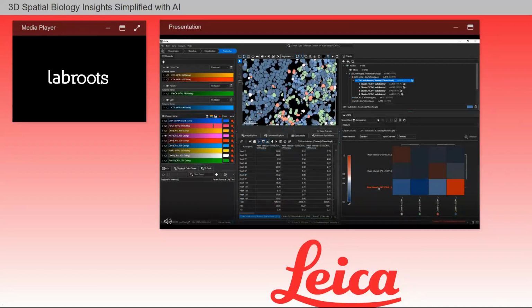I can also sort the dendrogram tiles by right-clicking on the header and selecting ascending or descending to sort the tiles by z-score value. Let's look at my phenotype output for all the cells and select the cell phenotypes as my object container. And I am going to select all the channels except DAPI to generate the new dendrogram.